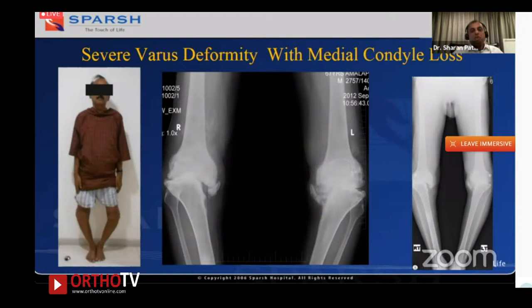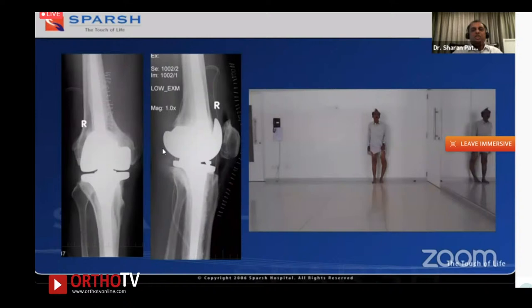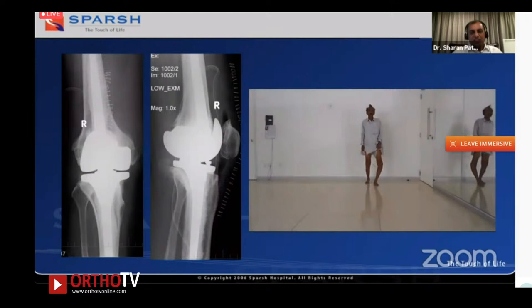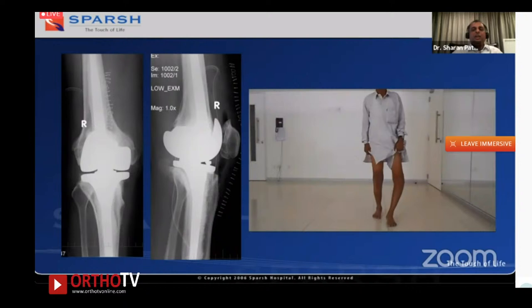Yet another extremely difficult situation: the MCL insertion is practically avulsed. As noted earlier, keep your full armamentarium of implants available. When you go inside and find it is extremely difficult to balance, you resort to a hinge — which is of course the last resort when ligament balancing is not possible. I've done the right side and am waiting for the left, which may also need a hinge.